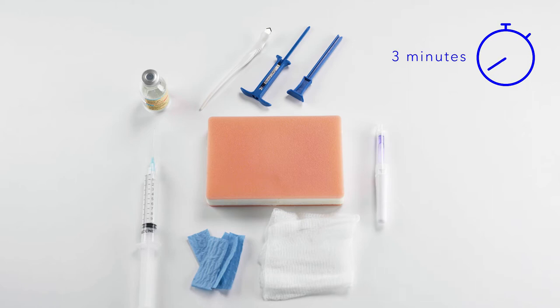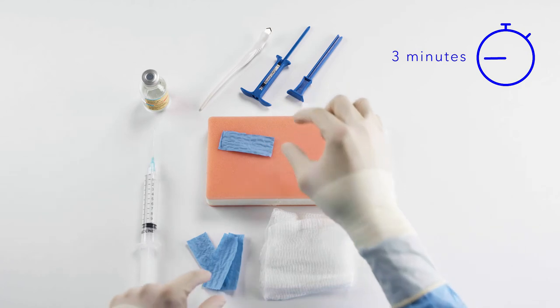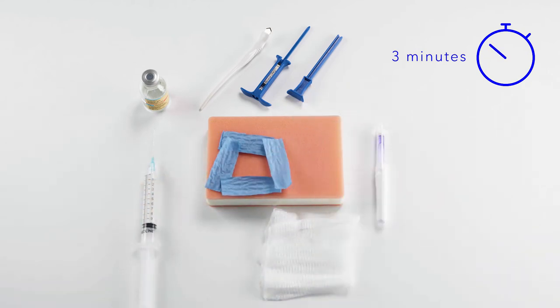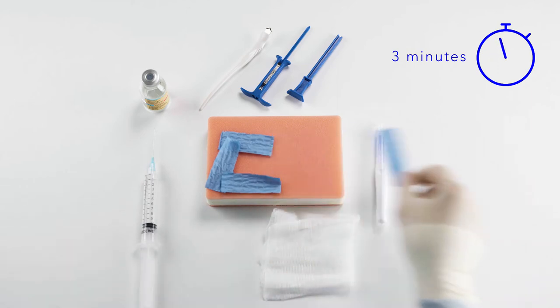While we're waiting for the chloroprep to continue drying, I'm going to apply four sterile towels on the left chest area as part of our sterile technique. For the demonstration, I'm going to remove these so you can better visualize the insertion technique later on.